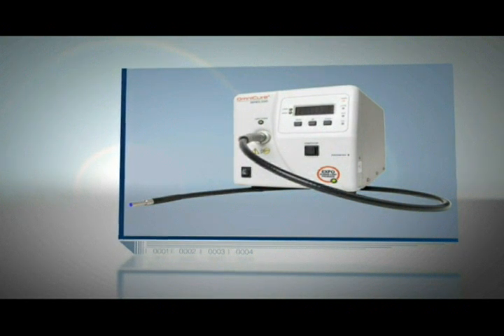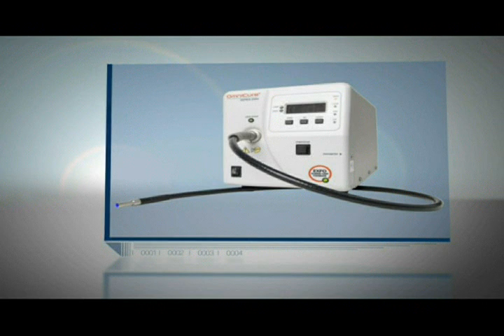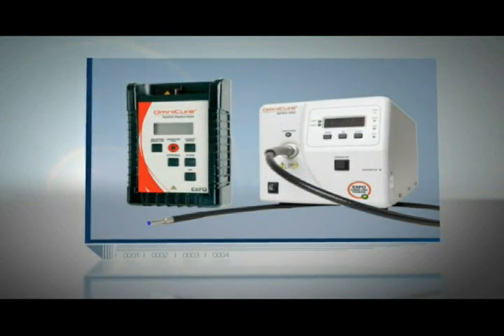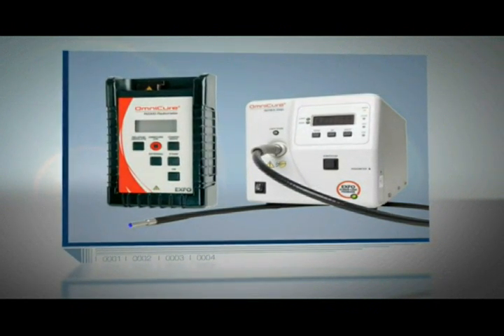This presentation will demonstrate how using an Omnicure S2000 with our proprietary closed loop feedback technology, an R2000 radiometer, and a high power fiber light guide will help in making a superior UV assembly process for balloon catheters.